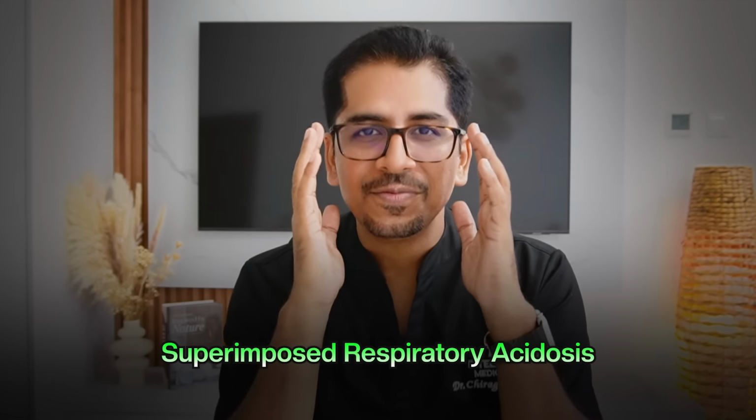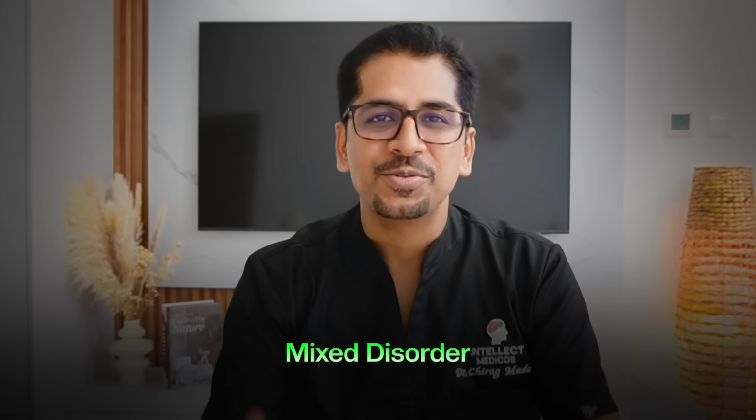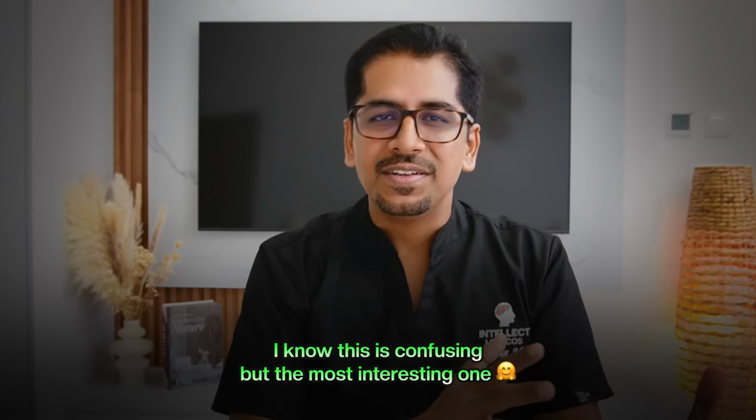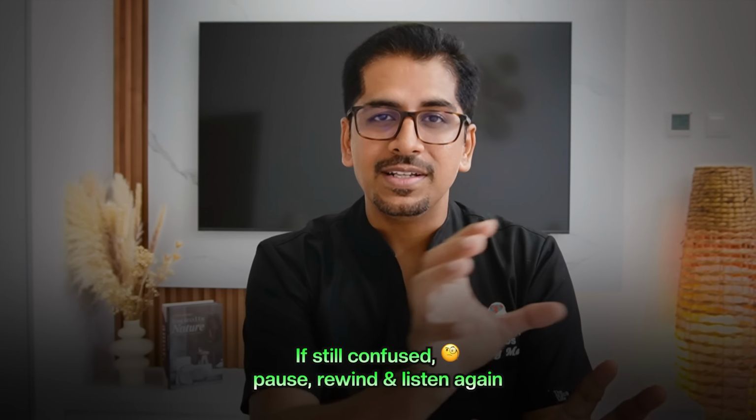I know this is somewhat confusing, how acidosis can come when the pH is 7.48. But yes, this is what a mixed disorder is, and that is why I discussed it as the last one, the 5th one, right? So try to understand, try pausing, try rewinding and coming back to it, that first we have to assess the primary disorder, which comes out to be metabolic alkalosis. Putting the value in that equation, it finally comes out in the range of PaCO2 which we expect from the patient, 40.2 to 50.2. But actually, in the ABG, the patient has a PaCO2 of 58.